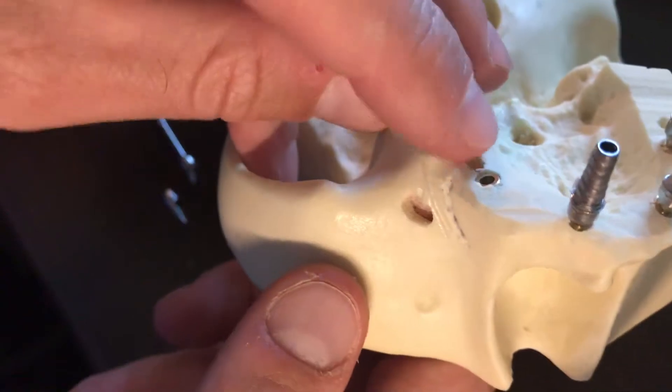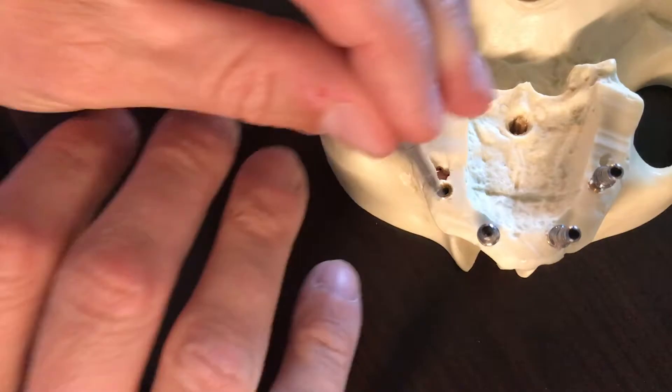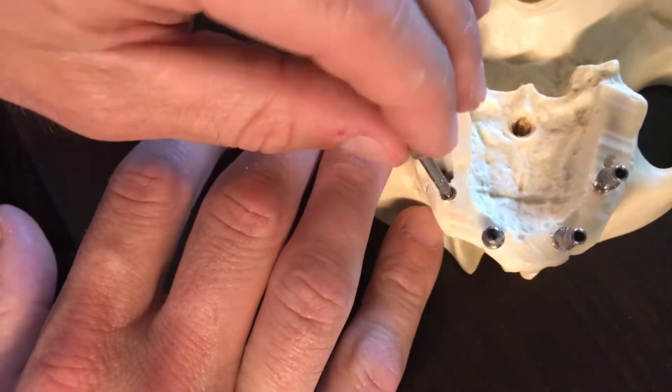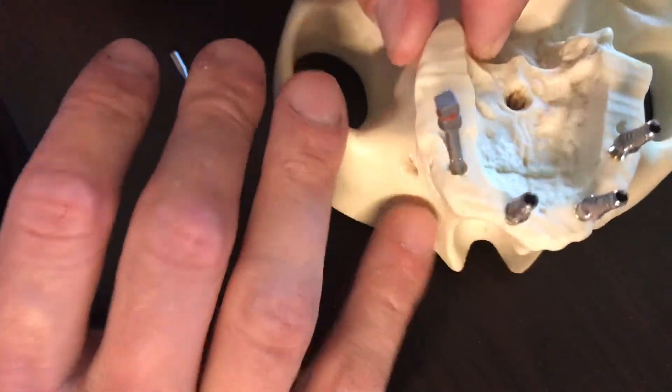We're going to spend a couple minutes on how to get this last implant on a weird angle to make sure we have all of our angled mini conical abutments match up.